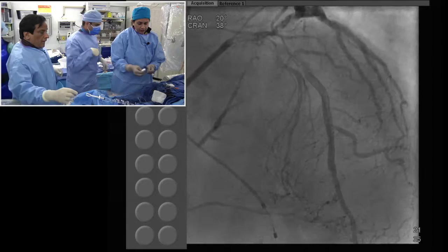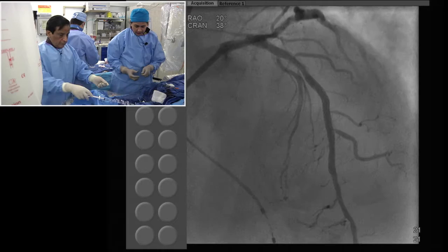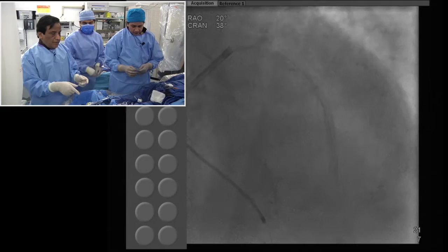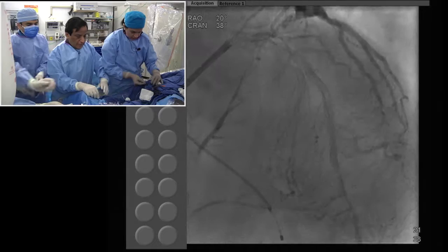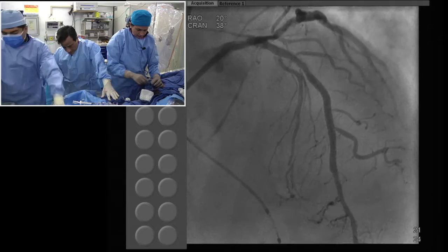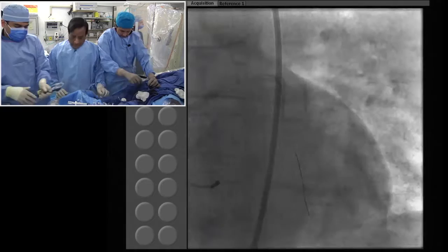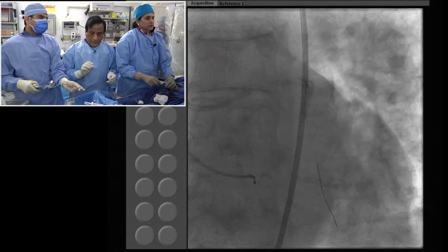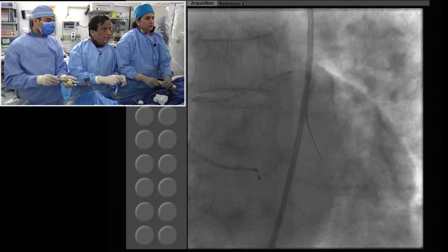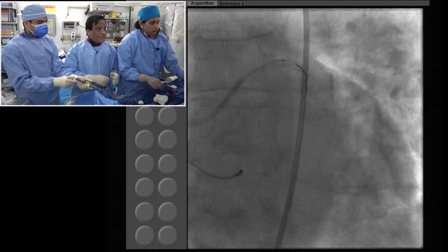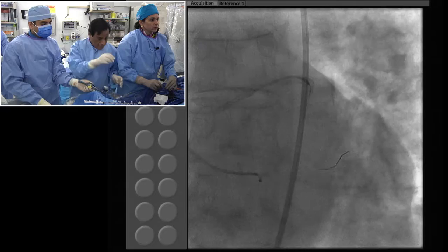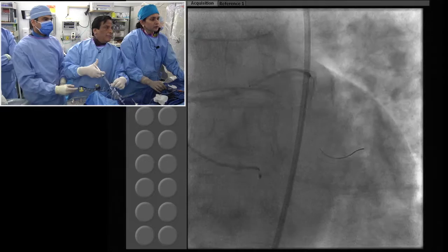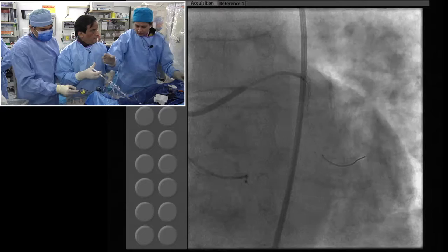Do not give any additional dye because this patient has to come back for the rest of the workup. In that particular case, we can do PFTs and carotid studies — those are part of the minimum requirement. The plan is to make sure we take a good picture and confirm the caudal view to verify the left main origin of the circumflex. We need to make sure every time we try to get the guide out slightly to see the proximal edge of the stent — the distal edge looks good and the circumflex is nice.